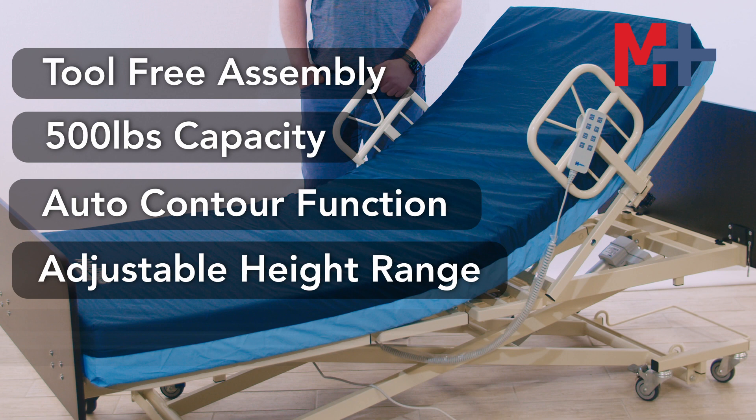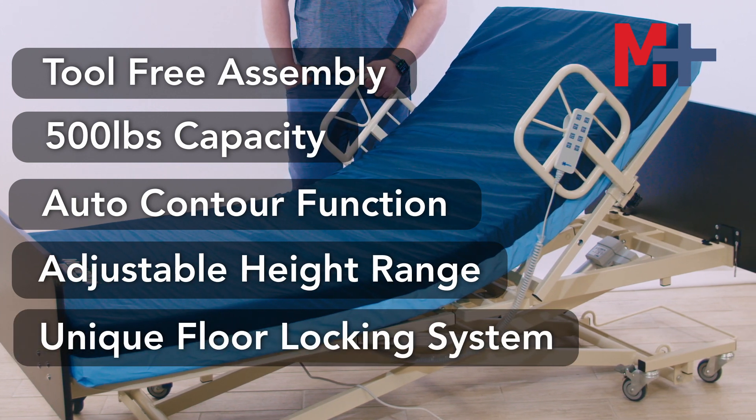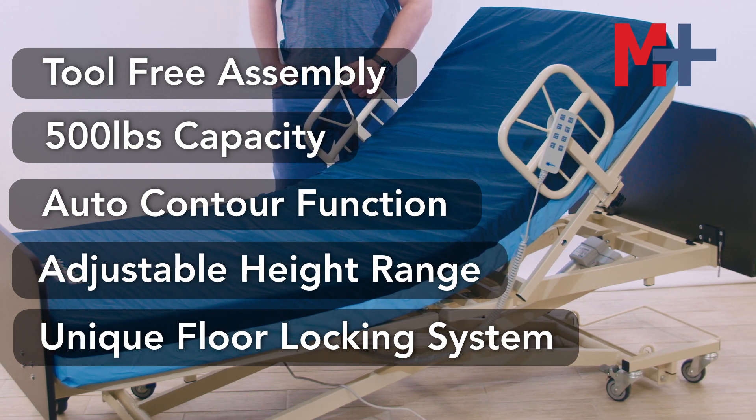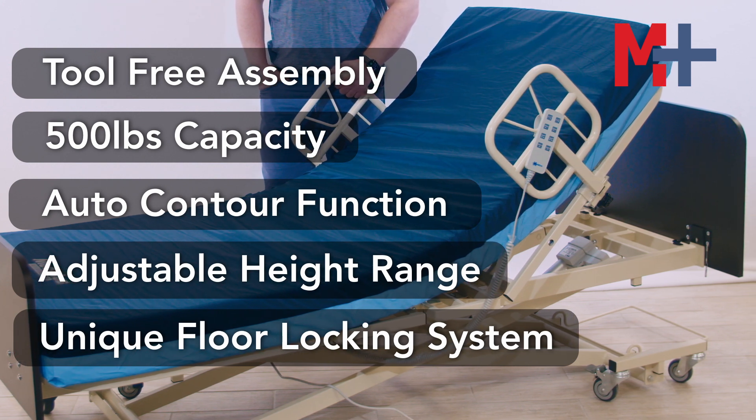The SafeCare bed features a unique floor lock system that secures the bed to the floor at all height ranges but allows for mobility on demand. An easy-to-read indicator alerts staff that the bed is off its casters or not locked properly — all very unique features to this bed.